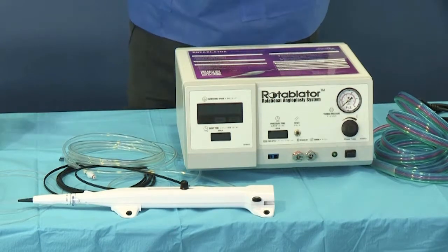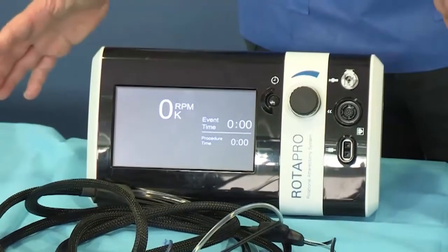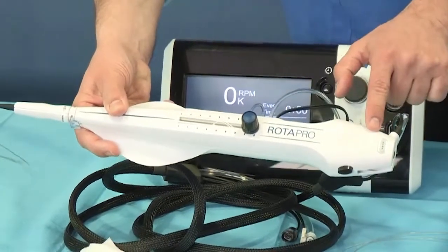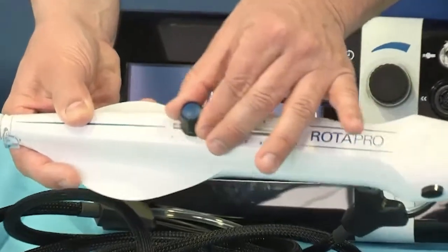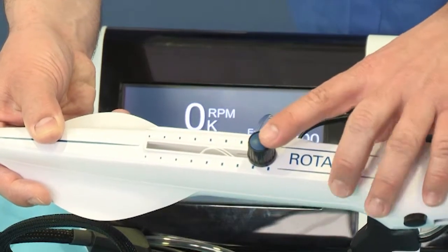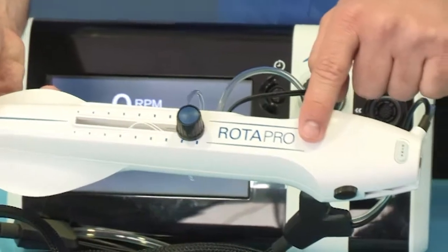But now let's move on to the new system, the ROTAPRO system that is here. You can immediately see some major differences. First of all, as I said, the pedal has disappeared in the new system, simply because all that the pedal did has now been put on the advancer. The knob that you see here, which you're already familiar with and which is used to push forward and pull back the advancer, has now been joined by this blue button on the top. If you click or de-click on the blue button here, you will activate and deactivate the motion of the rotor.